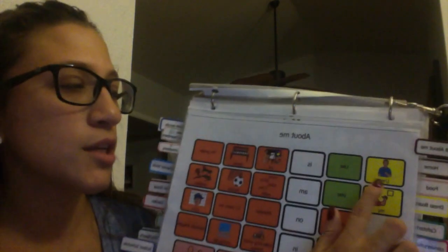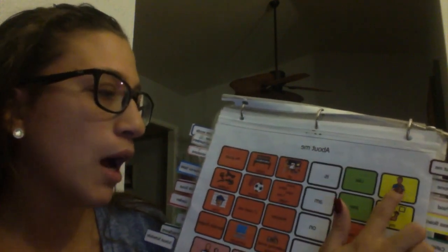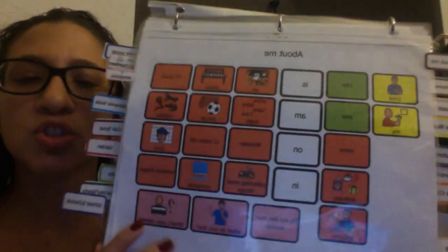So as you can see, first will be the all about me page, a way to introduce himself, such as, I like the art, I like piano, I play soccer, I like reptiles, my birthday is in June, my name is Brandon. This page also gives him a way to communicate with others and engage in social interactions.